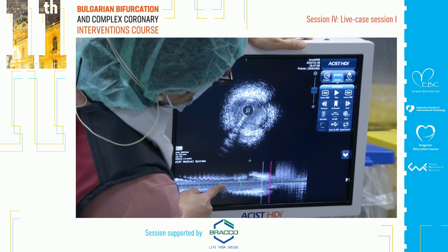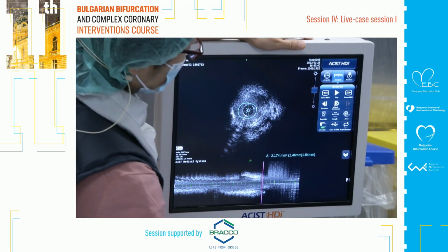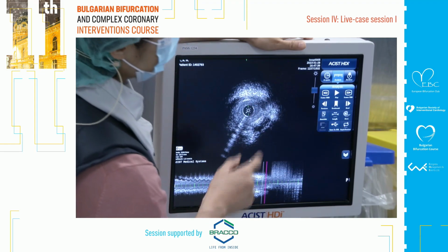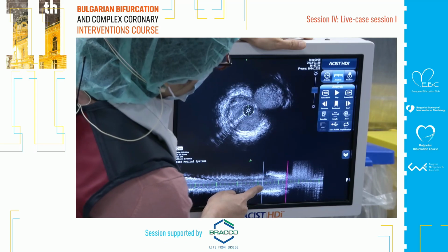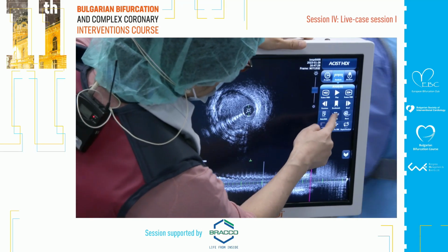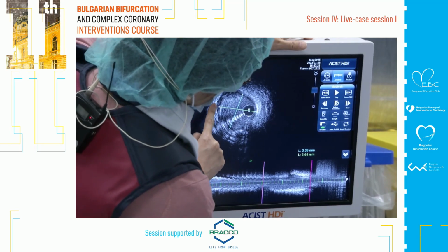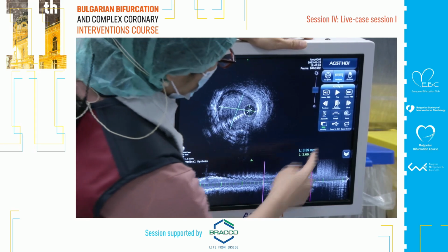And then we come back. This is a super short left main, and here this is the ostium of the left main. I think this is super severe. Minimum lumen area is only 2.1 square millimeter. So I do think that you should do two separate things. This is the ostial left main you should cover, and then cross over to the circumflex. And then somewhere here, that's a good landing. And the media to media is 3 point something, 3.6, 3.3. So 3.0 or 3.25 stent.